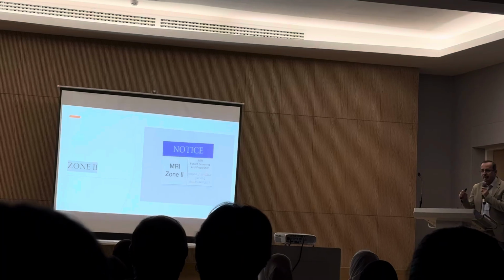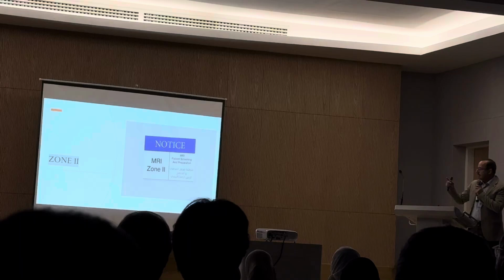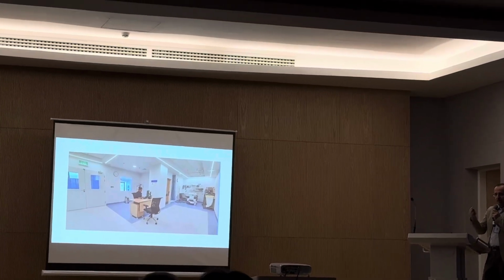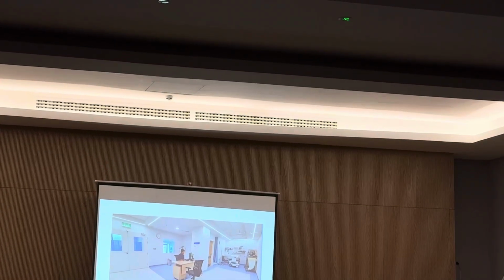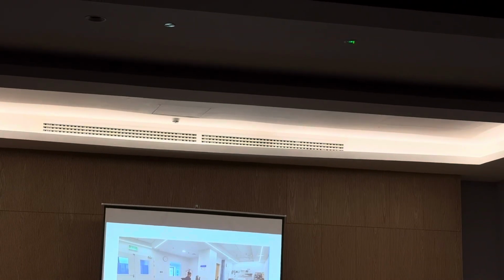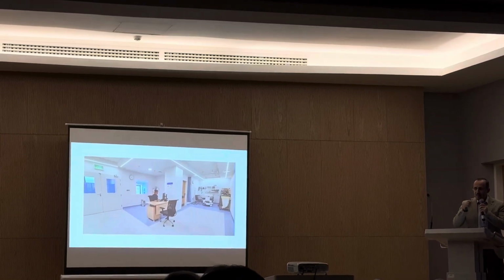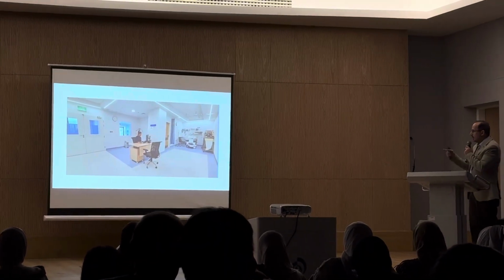The second zone is the zone between the public safe zone and the third restricted zone. This zone is the zone of examination, greeting the patient, preparation, taking parameters of the patient's weight and height, and documentation of the patient data and the clinical history. In this zone, we have a nurse and a level 1 radiographer. What is the meaning of level 1 radiographer? It is a radiographer who has adequate information about safety of MRI, including contraindications and things that the patient should eliminate from his belongings and clothes.